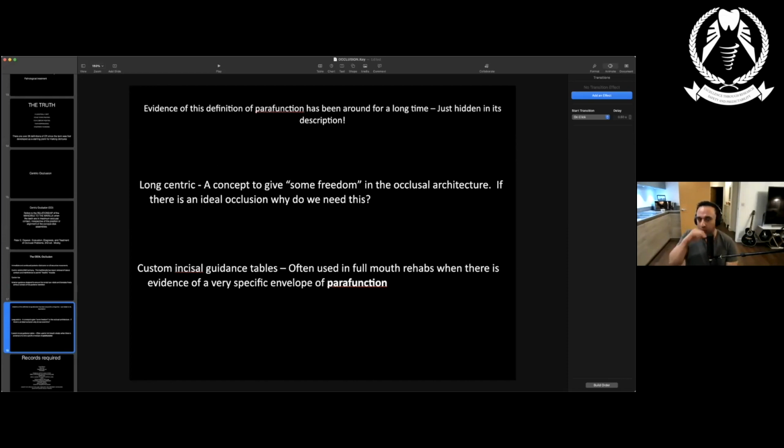So years ago, well, not years ago, we used to use articulators quite a lot. And you'd ask your technician, on a set of study models, to get them articulated with a semi-adjustable articulator. They get a tiny bit of Duralay, and they'll put it on the pin, and they'll run the pin through it as they're guiding the mandible forward, backward, left, and right, and they keep it to the side. And that's a record of your guidance table. That means that whatever restoration they do, they've got the guidance of what it was before.